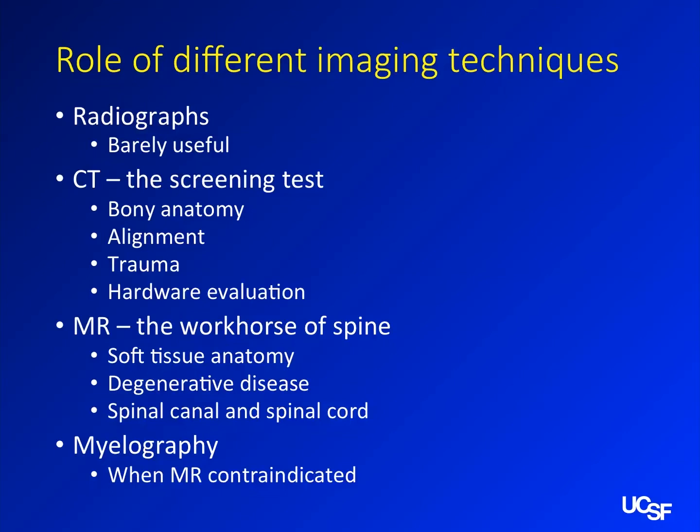But the real workhorse of spine imaging is MR because you see the soft tissue anatomy so well. You see the spinal canal. Myelograms are sort of going the way of pneumoencephalography. There's some old school ortho surgeons who really want them before they take people to the OR. But the reality is anyone who has a high quality MR does not need a myelogram. The reality of it then becomes when the ortho surgeon wants it, you still do it because radiology is a service oriented profession and you do what it takes to make them happy.